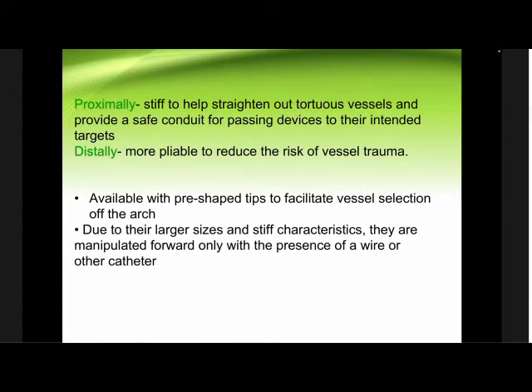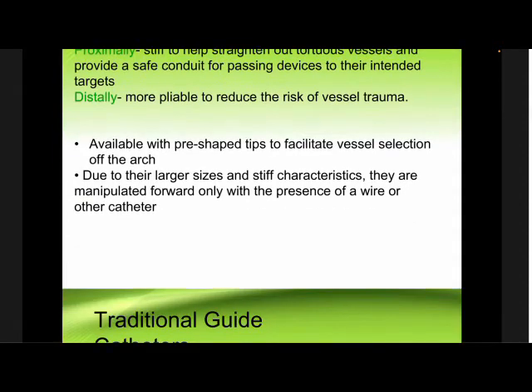These are usually available with pre-shaped tips for selective introduction into a vessel, and they are relatively large and stiff, so they are only manipulated in the presence of a wire or another catheter.